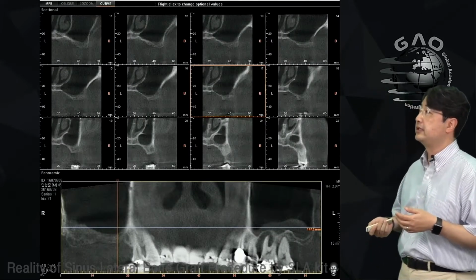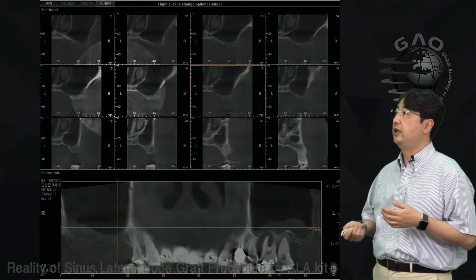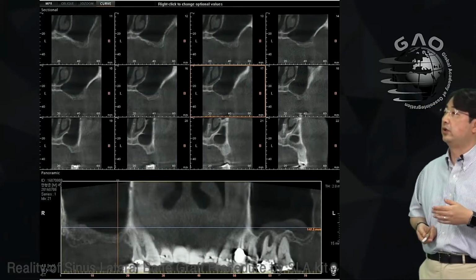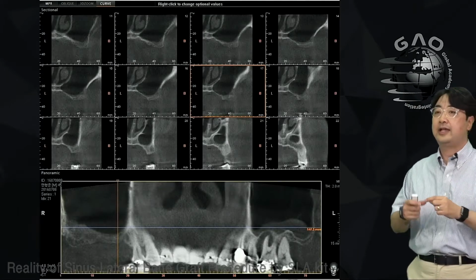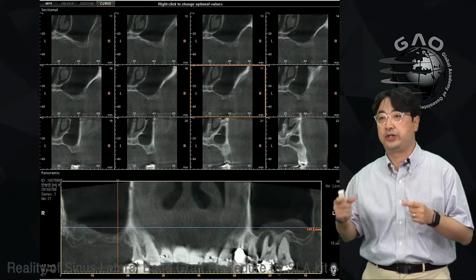Okay, so this is the panorama CT scan. As you see, here is the opening, right? Like this. So this sinus, the anterior lateral wall, has the opening, the window from the previous surgery, right?